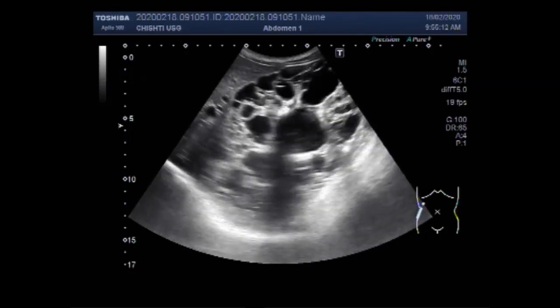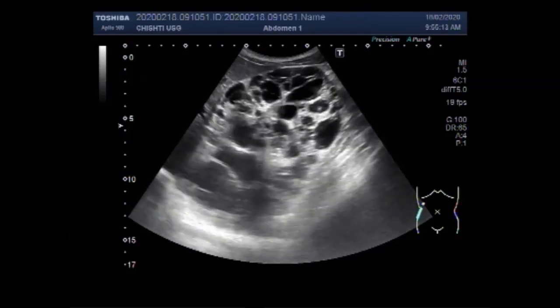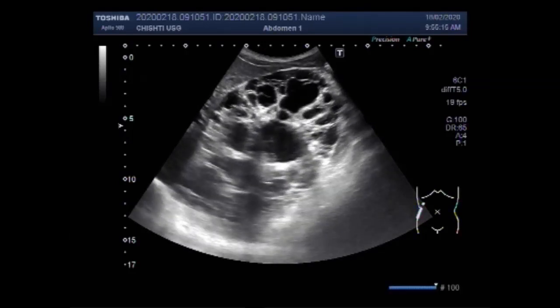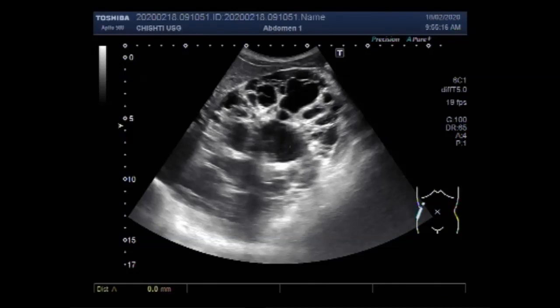This video also shows enlarged seminal vesicles in the same patient. You can see the size of the kidney is increased.